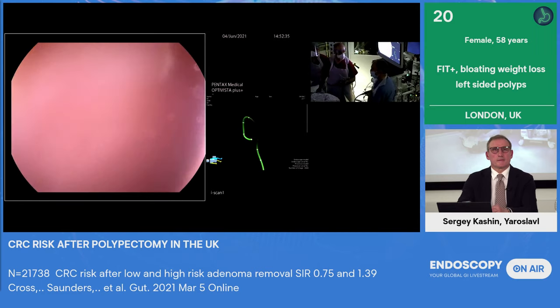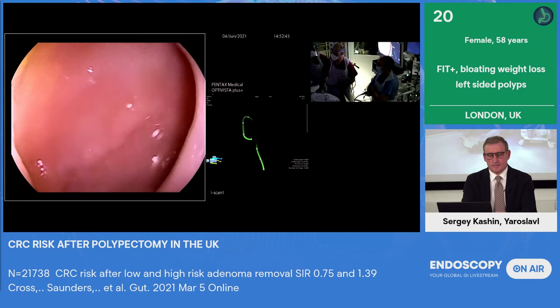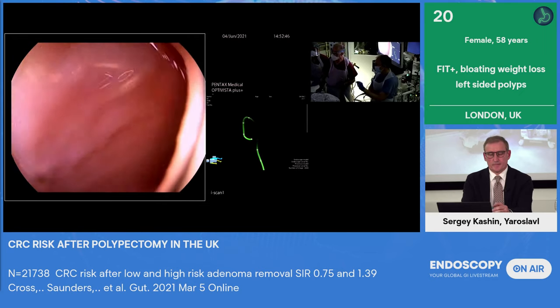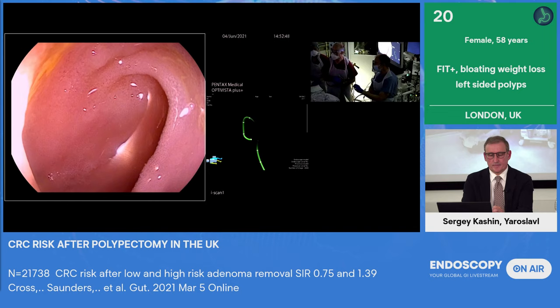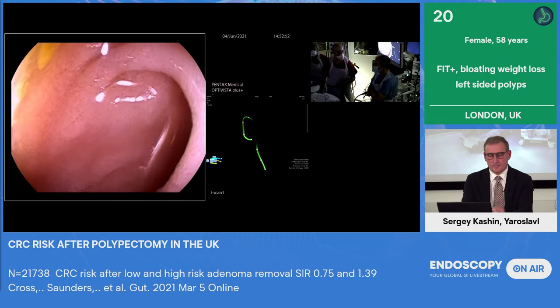How many of those 10,000 patients do you think the capsule is going to get stuck? Because it's, well, a lot bigger than a standard capsule. It is, but because you're using it in a different population from your small bowel capsule patients, actually the capsule retention rate is incredibly low. That's not the issue. Fantastic.